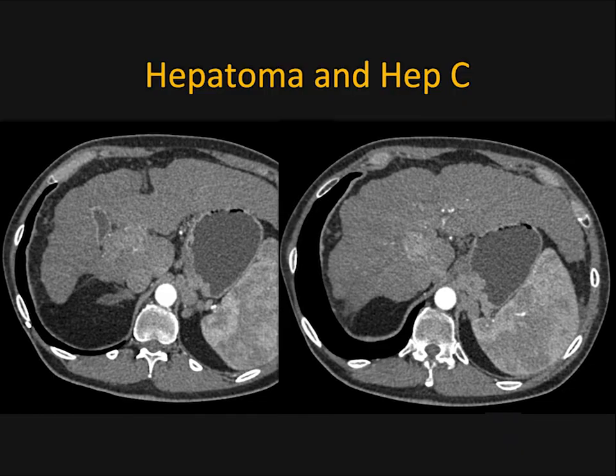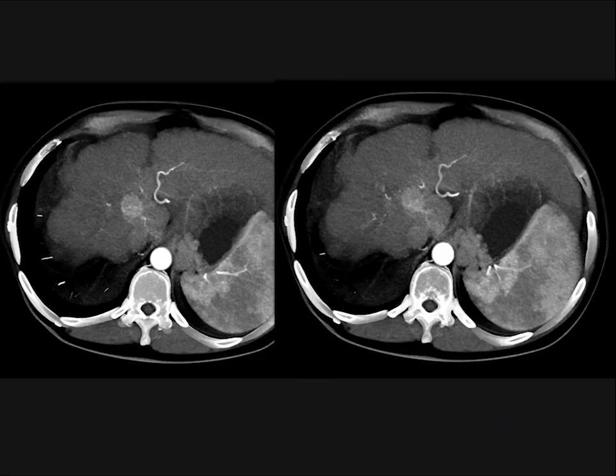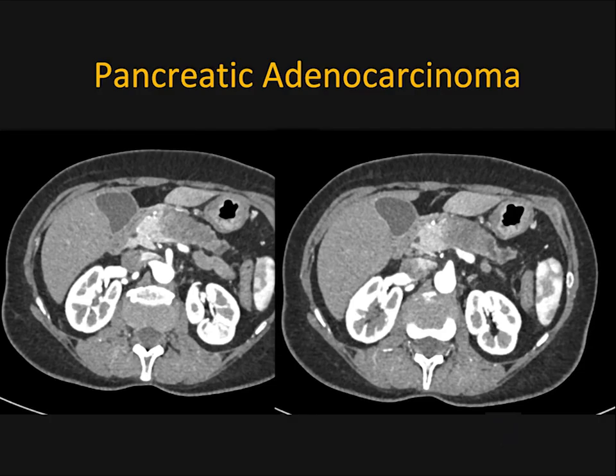Or in this case, in a patient who's cirrhotic and there's a 2.5 centimeter mass, right lobe of liver near the caudate lobe, it's a bit subtle on the axial imaging and a bit easier to see on the MIP. You recognize delivery of contrast is critical. If this patient had delayed phase imaging or poor injection, you would not pick up this 2.5 centimeter mass.